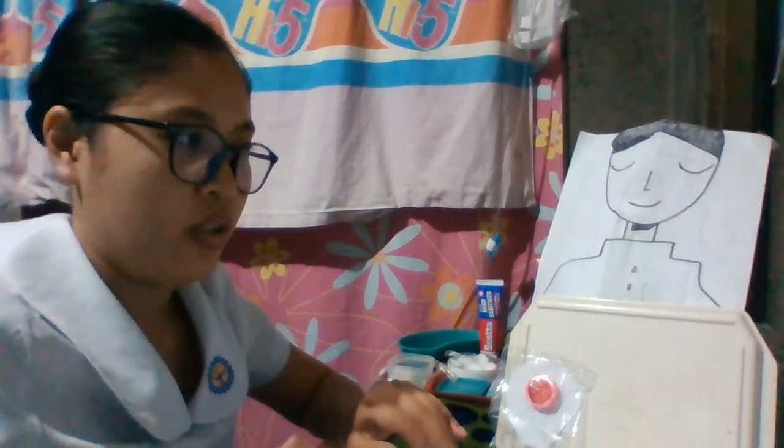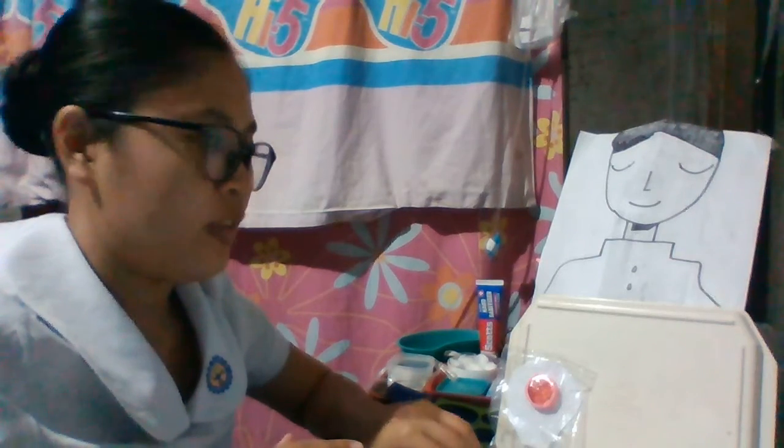Overall, that's fine, and the patient feels relieved and has comfort after the procedure, making sure that it was clean and safe.